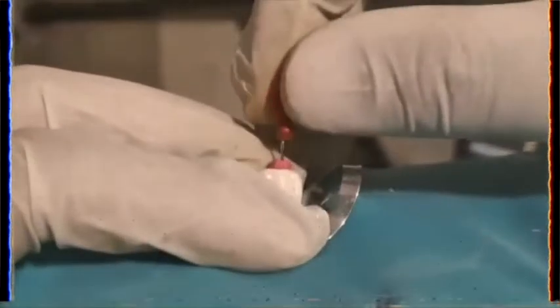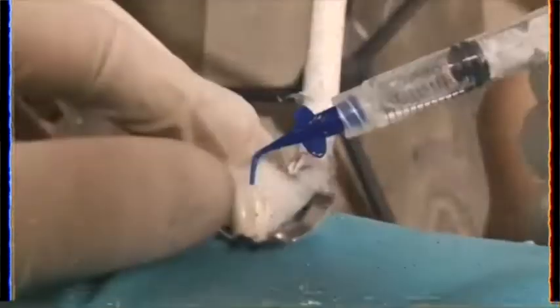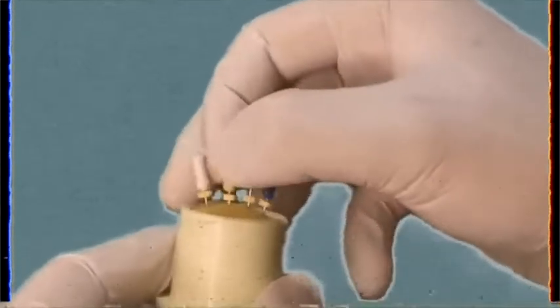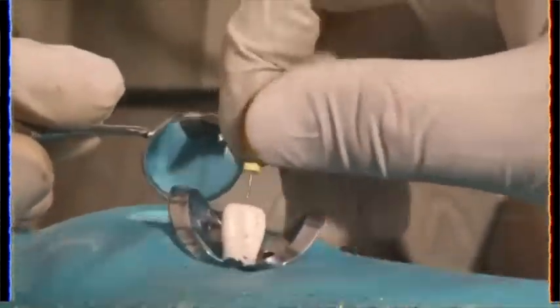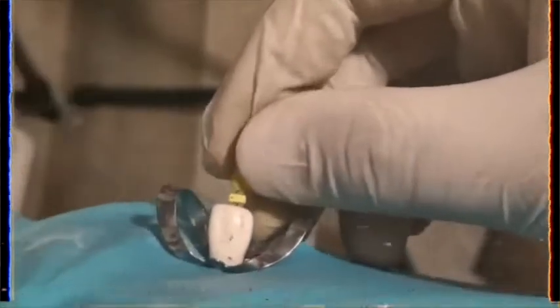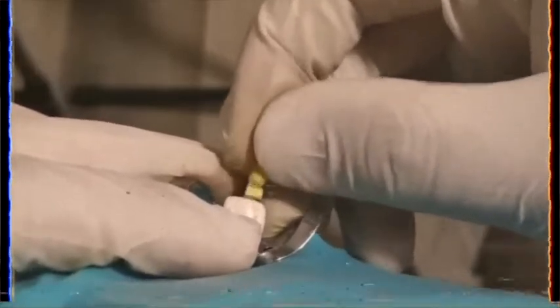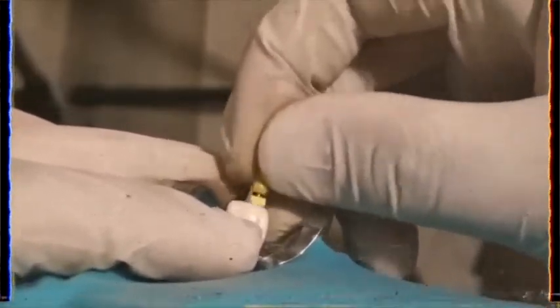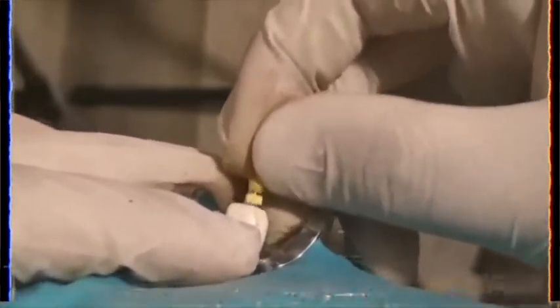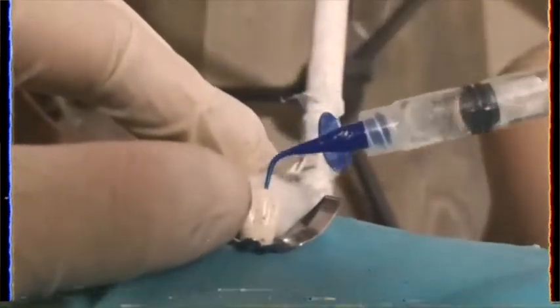When your succeeding file will not enter into the canal with the full working length, do not force it in, as you may cause strip perforations or even apical perforation. This may be caused by the creation of a ledge made by your previous file size. Return to your previous file size and redo the biomechanical manipulation. This protocol being done in this scenario is what we call recapitulation. Also, remember to irrigate before and after changing files.